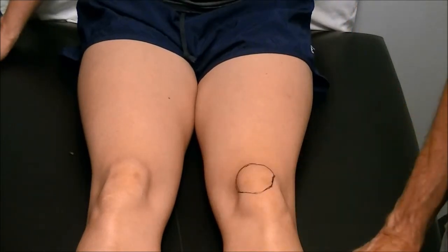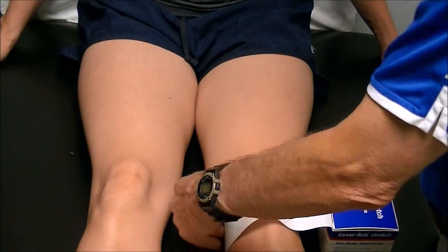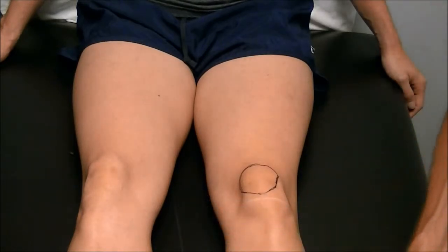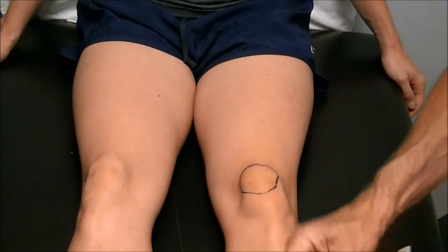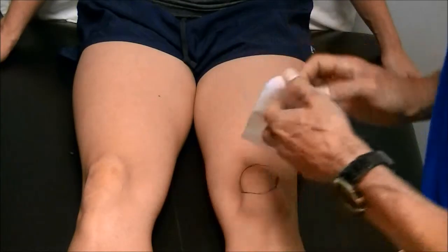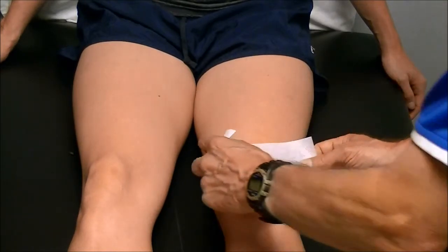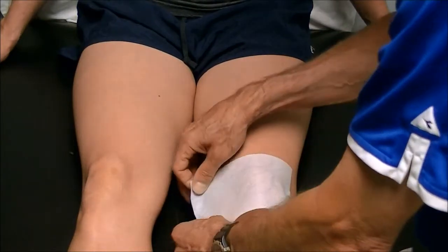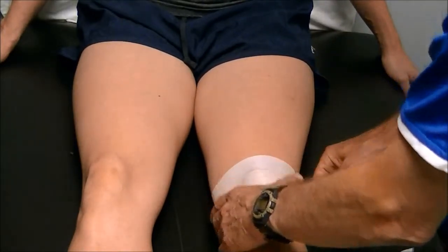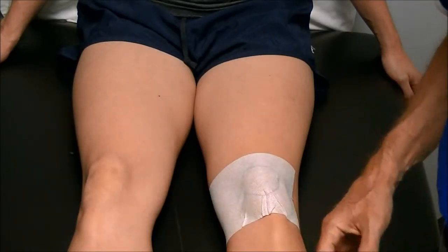Once the spray is dried, we go to the next phase of putting the tape on. To measure the cover roll, I like to start in front of the hamstring tendon and go to the outside about an inch and a half to two inches beyond the kneecap itself. I like nice sharp scissors. On a windy day this is the hardest thing to do because the tape flies everywhere. I measure out the kneecap — if you don't have it drawn out like I do, I get the little white areas and go an inch and a half to two inches on the outside. I don't mind wrinkles on this tape. It really can form a second skin — I've used this on strawberries, on the rear end, around the knee cuts, around the shin. It moves with you; it's a great tape, though unfortunately it's very expensive.